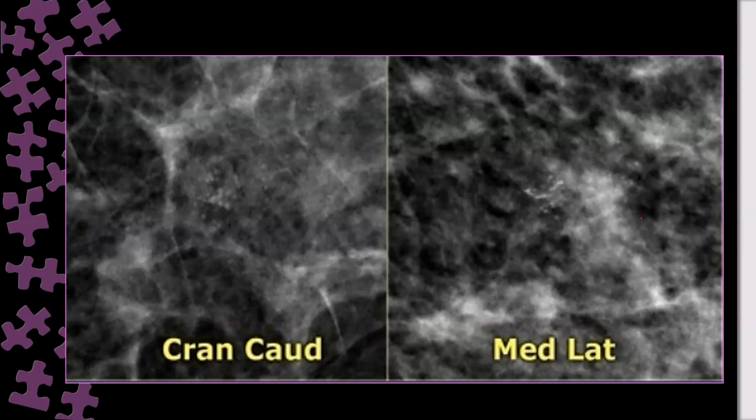Have a look at it carefully. Close. If you're more linear. Change. Does it change, Fatma? Yes. Maija, does it change? Does it change on the mediolateral view, or does it look the same? It has changed. It's excellent.